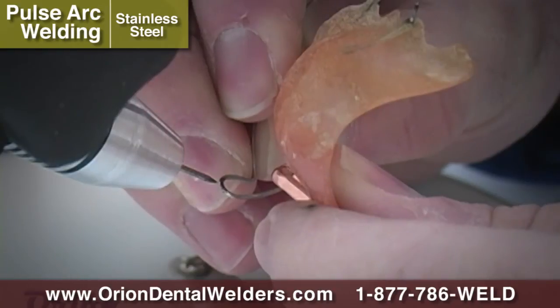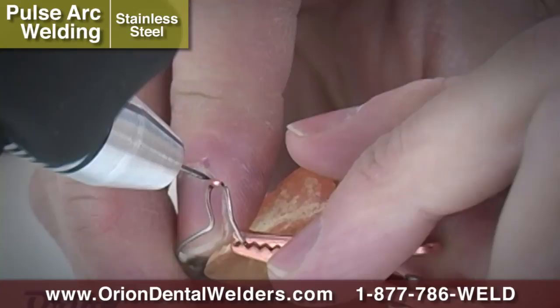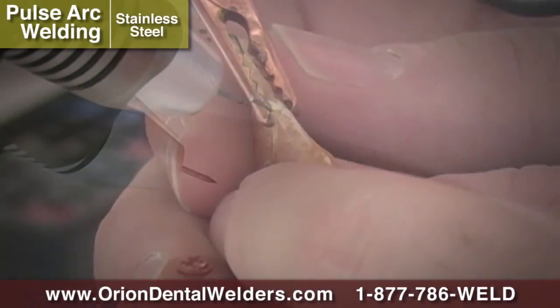In this example, a retainer wire has been broken. The Orion can be used to rejoin this wire without any additional material being needed.